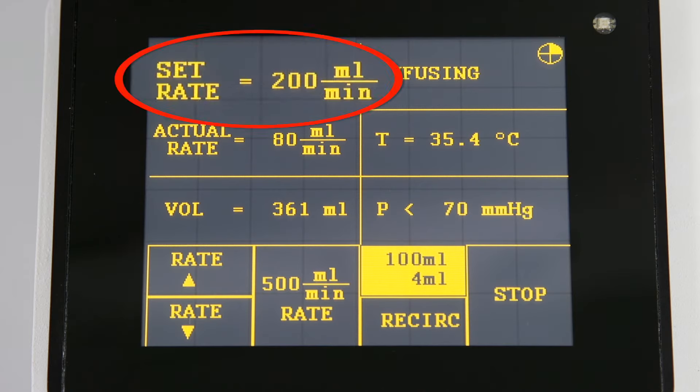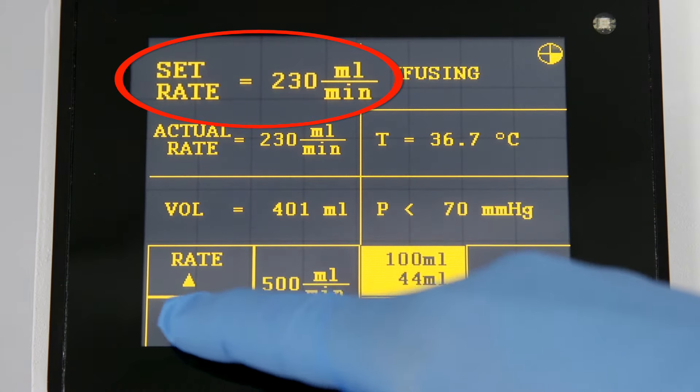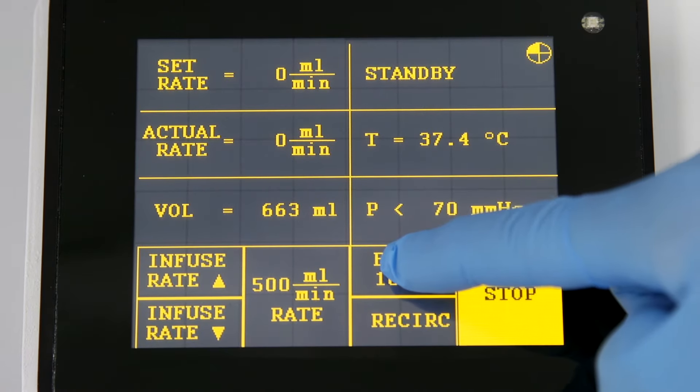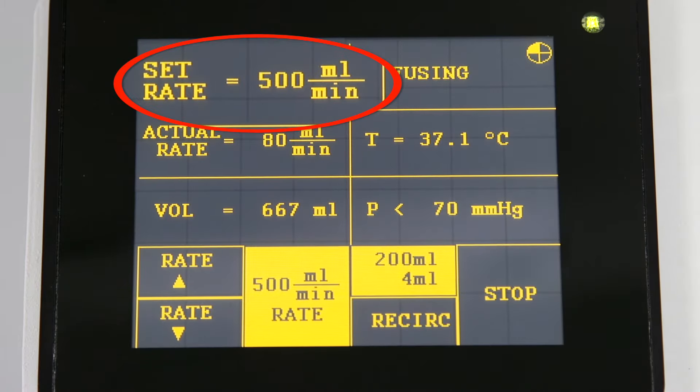The default infusion rate is 200 milliliters per minute. To change the infusion rate, simply press the up arrow to increase the rate or the down arrow to decrease the rate. If you would like the bolus to be delivered at 500 milliliters per minute, press the bolus key and then press the 500 milliliters per minute rate key.